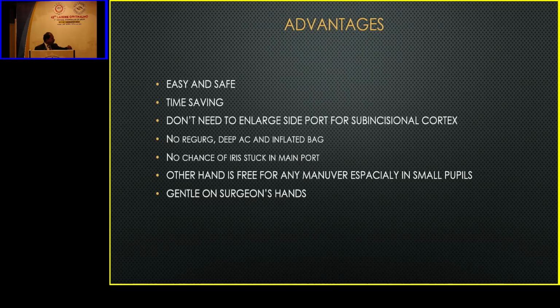It's trying to shift to the automated IA because it's a very easy and safe technique and it's very time saving. You can learn it within a couple of months or rather a couple of weeks. You will become an expert, and the learning curve is very fast. If you do a surgery or cortical aspiration with conventional IA or simple IA, and it takes 1 minute, this will take only 10 seconds.